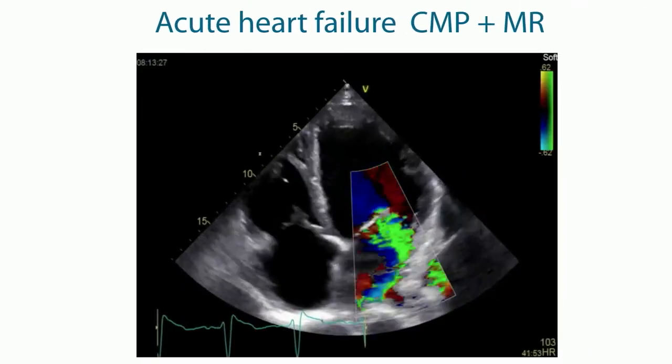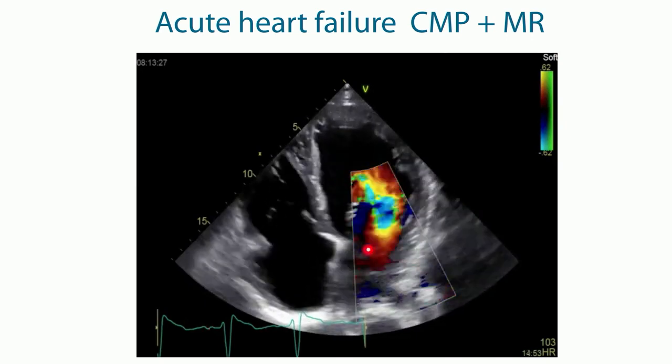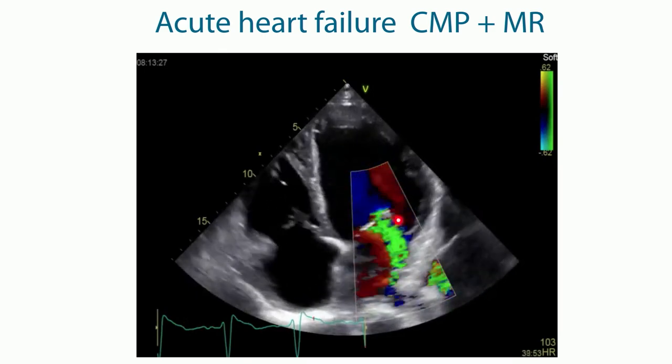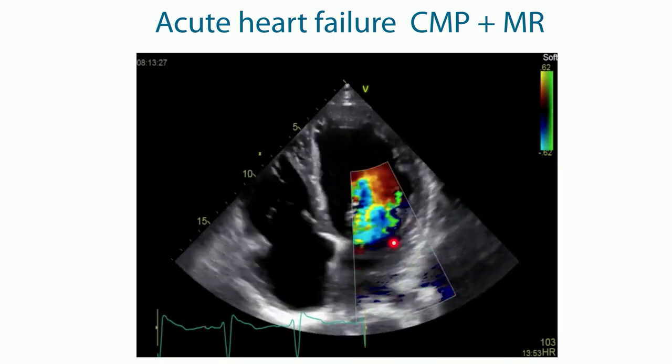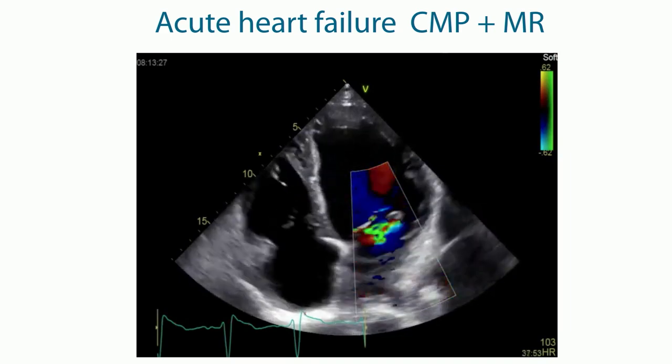With point-of-care ultrasound, we visually assess left ventricular function, and we are able to differentiate patients with severe from those with normal ejection fraction. But there are other pathologies we can detect as well, especially if we add color Doppler. What we can see here in this case is severe mitral regurgitation. You see a jet over here, aliasing, so the rapid change in red and blue color.